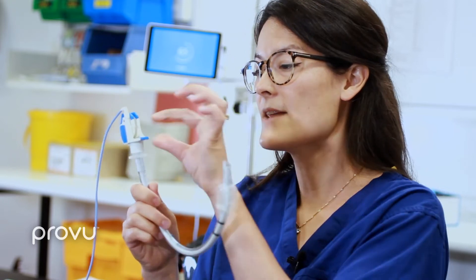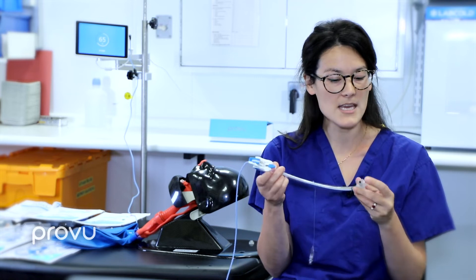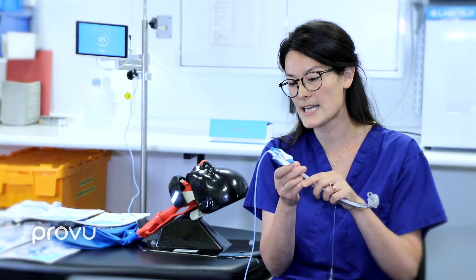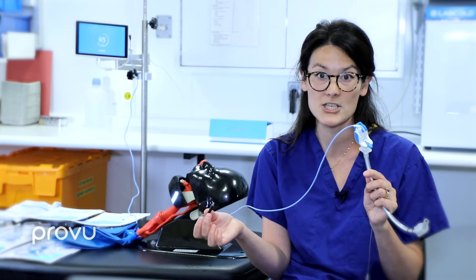It has an internal rod, making it very malleable so you can shape the video stilette, and that internal rod can be removed from inside. The video stilette sits just inside the tip of the tube so the camera is at the end, and you can plug it into an external device — these can be a whole range of high-definition devices — giving you a shared view of the airway. The tube and video stilette are disposable, but the video screens are reusable.